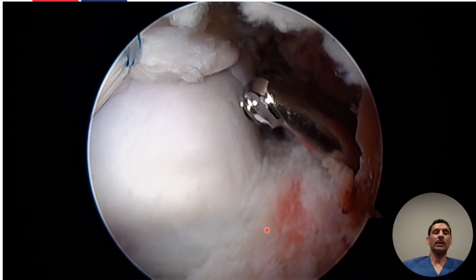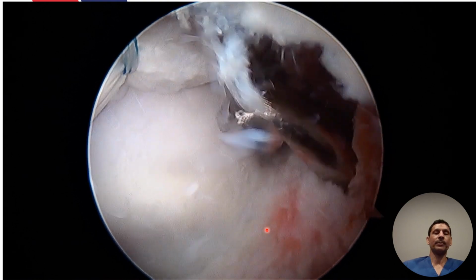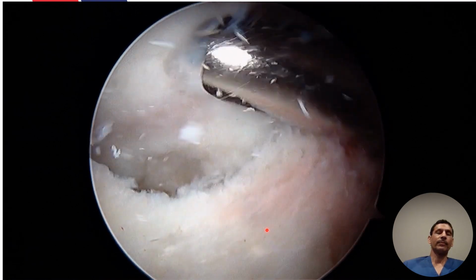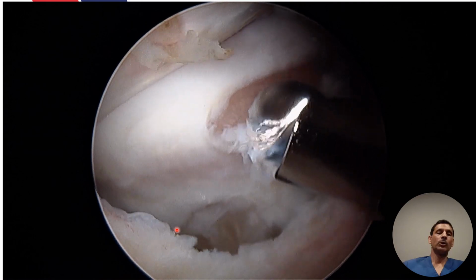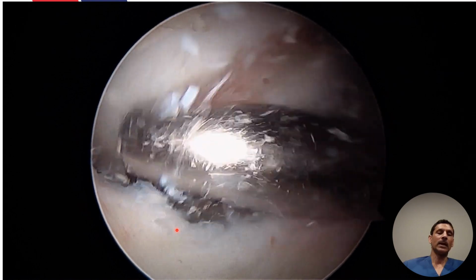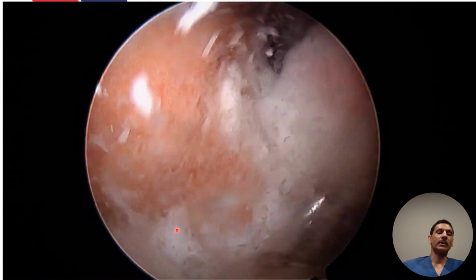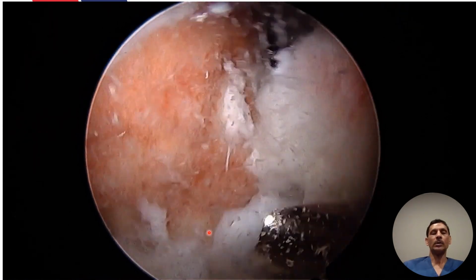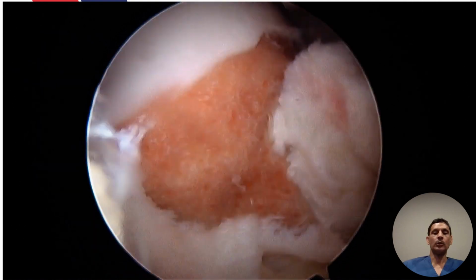We use fluoroscopy liberally at this phase because the roundness of the head should be confirmed by fluoro also, not just by visualization. Same burr, removing the abnormal extension of the epiphysis, going medial to the red band on the head-neck junction. So cam osteoplasty typically goes from about 6 o'clock to 12 o'clock, the entire anterior aspect of the head-neck junction. Sometimes you go even beyond 12 o'clock superiorly, but almost never beyond 6 inferior. Going more and more lateral to make sure that the roundness is restored to the head-neck junction. And then the capsule is closed with the 2 sutures.